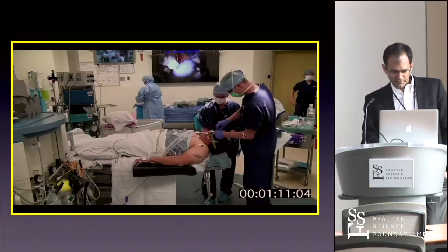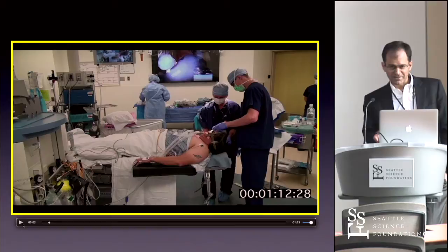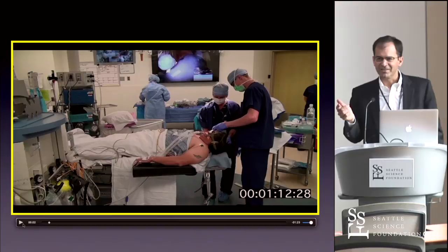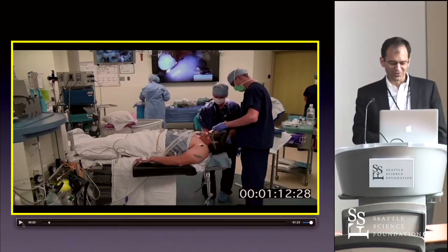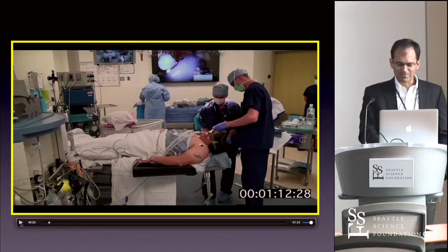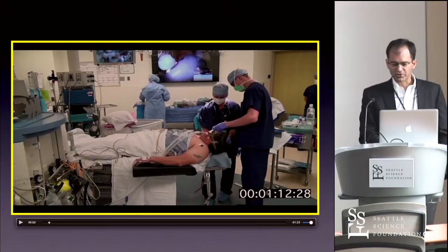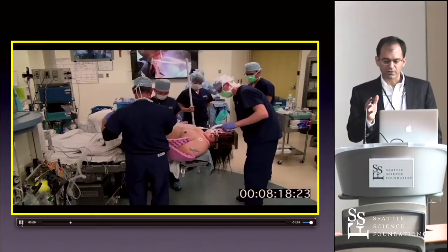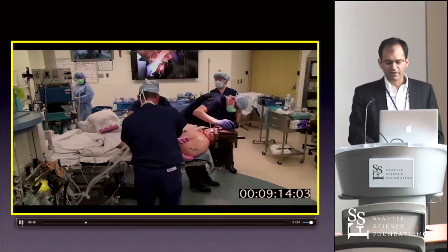This is Alex Whiting, one of our second-year residents. His dad is the chairman of neurosurgery at Allegheny. When Alex told me I was going to be debating his dad — who does DBS awake — I basically made this video to use his son as a human shield. This shows the workflow of asleep DBS. The patient is already asleep. You can see the time signature showing how much time is elapsing. We're just starting the frame, and everything happens in the operating room. Once the frame is in place, we don't move the patient.